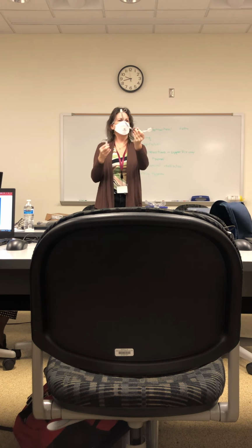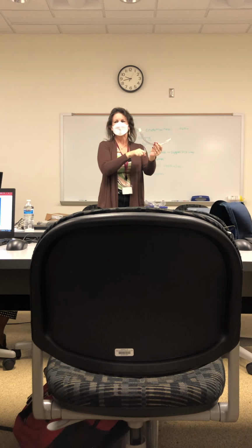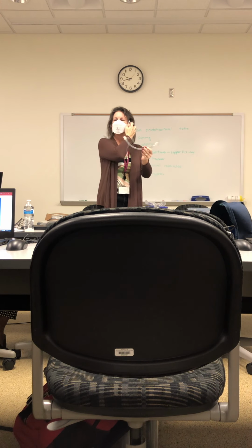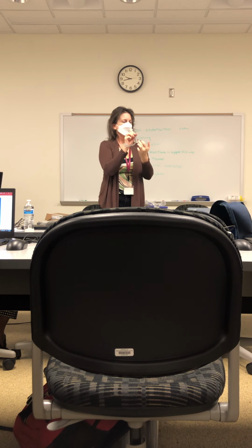Okay? If you filled it up too much, it would pop. This one is leaking a little bit. See how it's deflating a little bit? It's old. We use them a lot. Okay, so those are what we have for our tube.